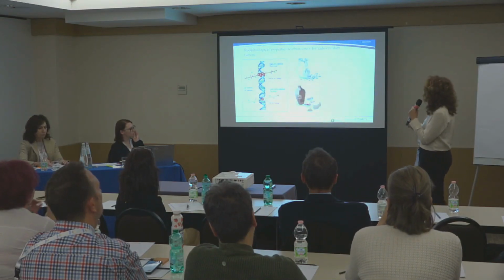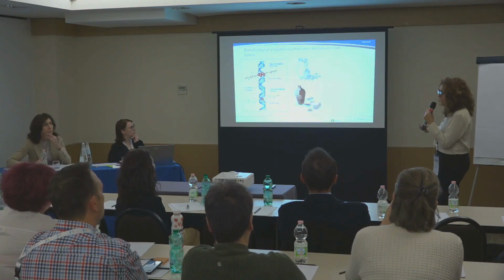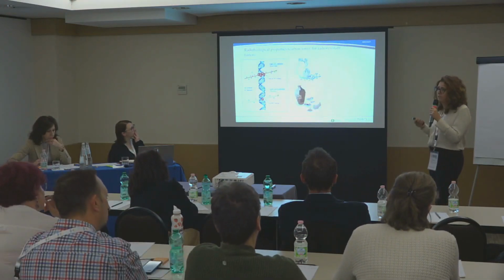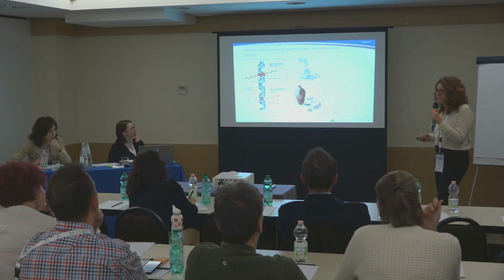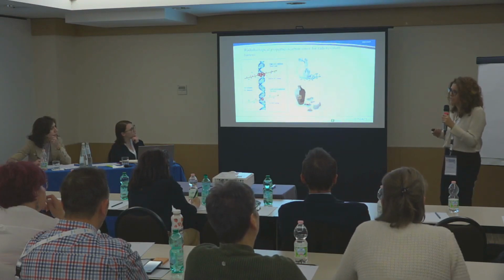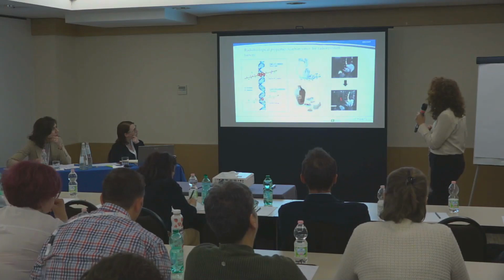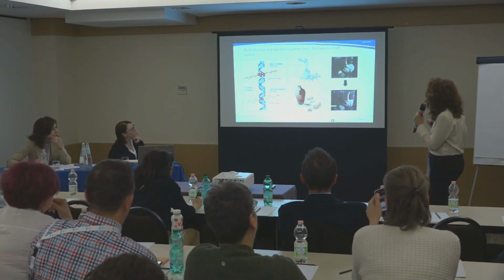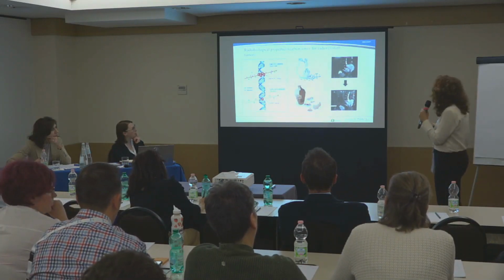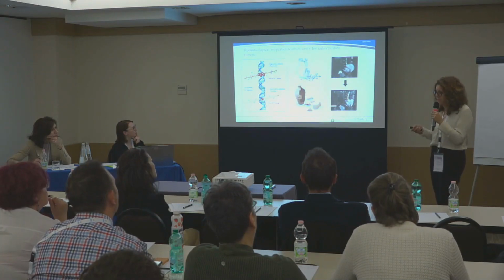This is a funny example: you can see it's easier to repair damage like that rather than multiple damages like that. But we have to take into account that there are bone sarcomas that are very, very radioresistant, such as osteosarcoma and high-grade chondrosarcoma. So we have to consider that we can have some repair, so recurrence, even when we treat with carbon ions, of course. But in the best case, we have results like this. This is a typical big sacral chordoma, recognized as one of the most radioresistant tumors. And after 1 year of carbon ion treatment, we start to see an impressive reduction of the mass.